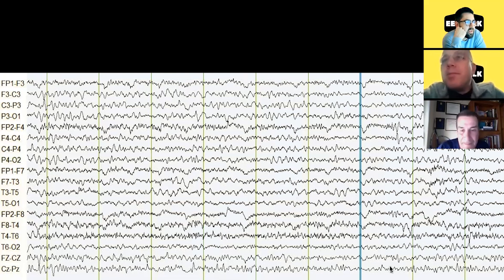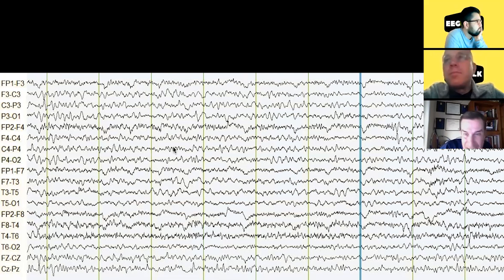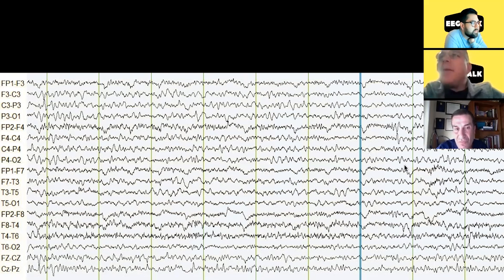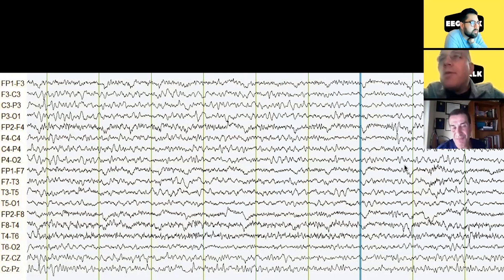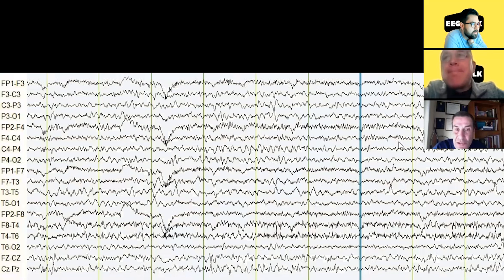What does it really mean to stand out? Two things: the amplitude is significantly higher than ongoing — and this one's amplitude is similar to what comes after — and it is usually followed by an after-going slow wave that disrupts the background. On the one on the right, its amplitude is a little higher than its neighbors, but it doesn't have an after-going slow wave. Also, it doesn't really have a morphology suspicious for an epileptiform discharge. And there is another very important rule: if we have to discuss it for this long to decide if it's a sharp wave, it's not.